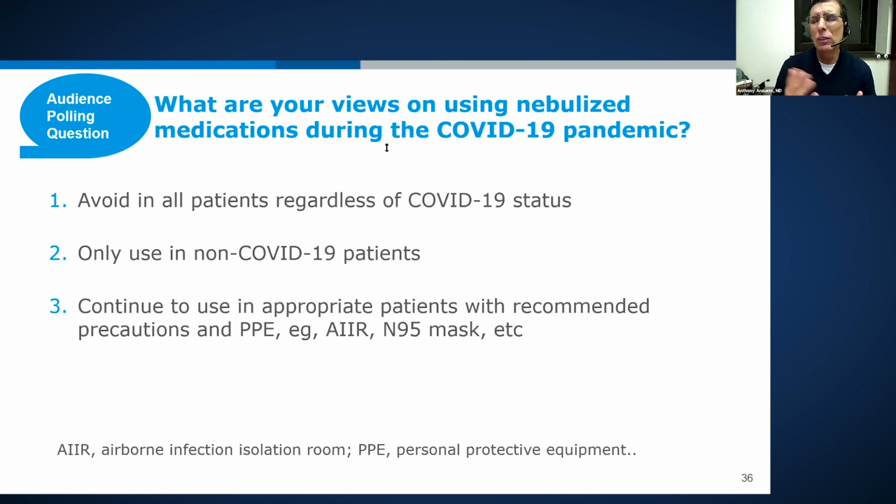And I will tell you, at the beginning of the pandemic, when we had patients on the ventilator, we went back to look at the literature, how many puffs we have to give of the CFC devices, and need to pump into the tubing in the system.